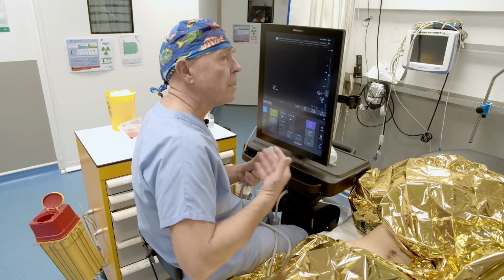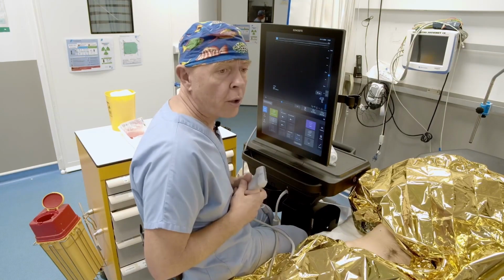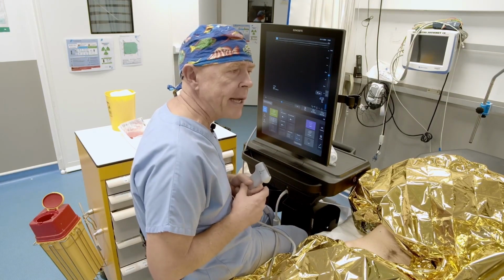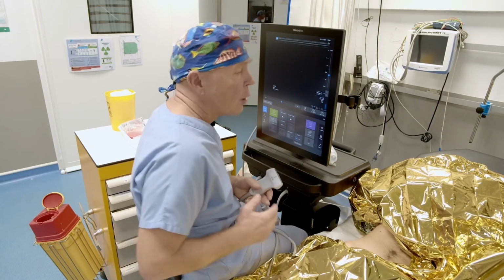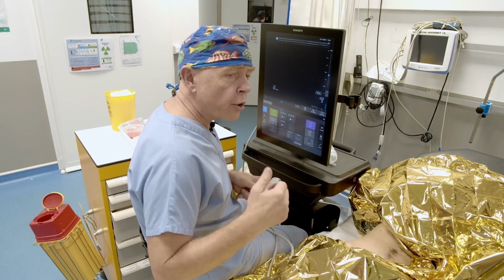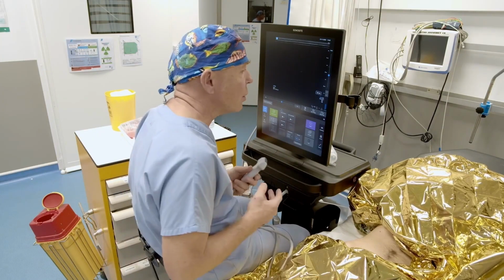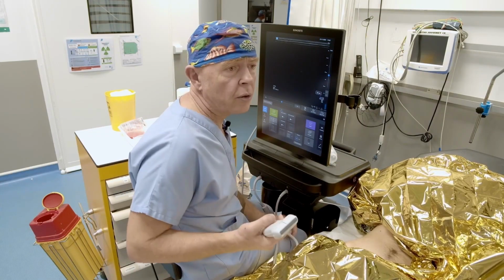A bit more intermediate, like the PEX blocks, the supraclavicular block, which isn't that easy, the iliofascial block via the suprainguinal approach, which can be classified as an intermediate block before tackling the paravertebral blocks. Quite simply because the angulation is greater. You are very close to the intervertebral foramina and also to the pleura. But it's a block that is extremely effective with an efficacy as significant as an epidural.